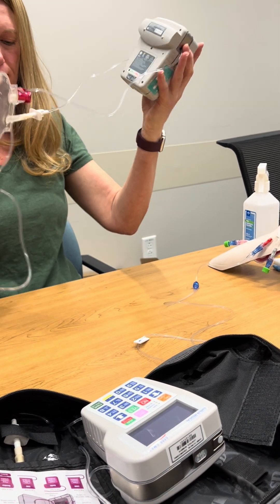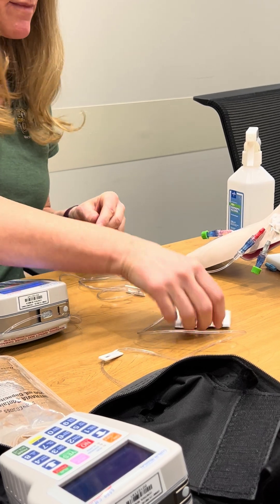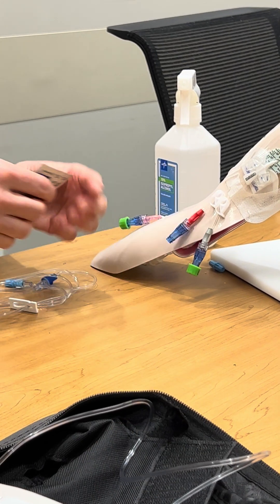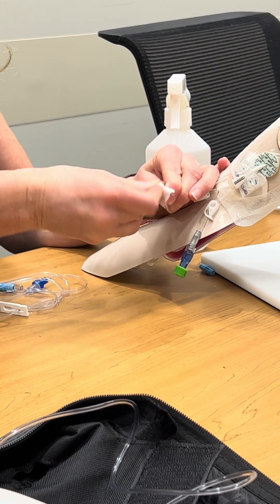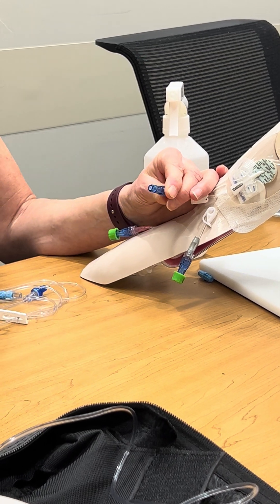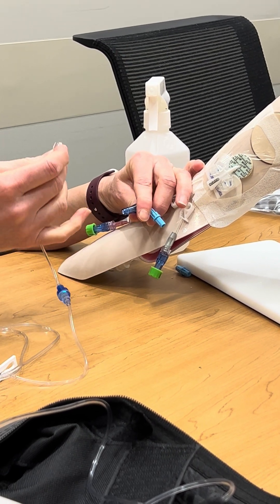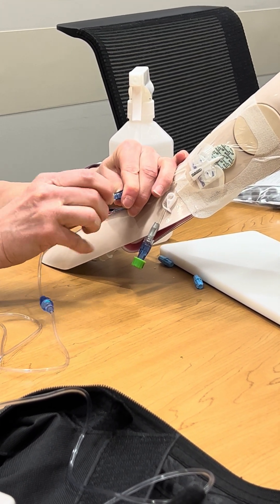I'm going to get this next pump ready. I'm going to wash and sanitize my hands again, and I'm going to remove this from the end of the PICC line. I'm going to scrub the end of that for 15 seconds. Now we're never going to flush the milrinone line, so I'm just going to scrub the end of this hub, wait for that to dry, and then hook up the next line. I'll twist that blue cap off — just be careful not to touch any ends that we've already cleaned. Push in and twist.